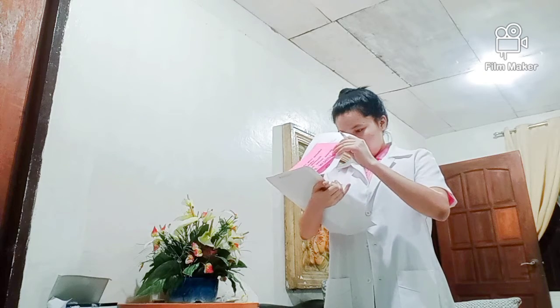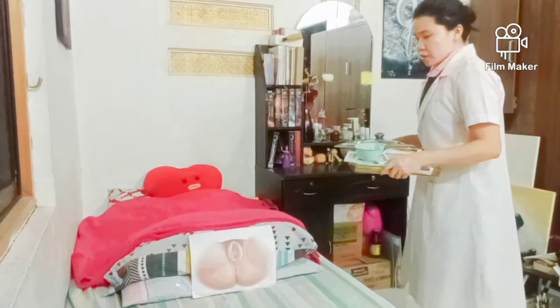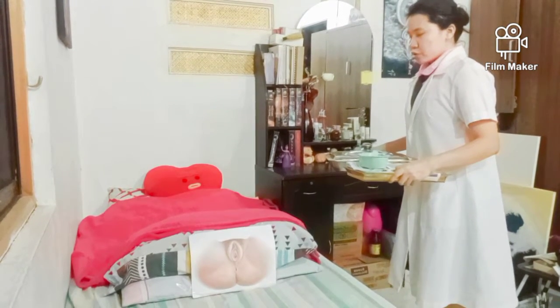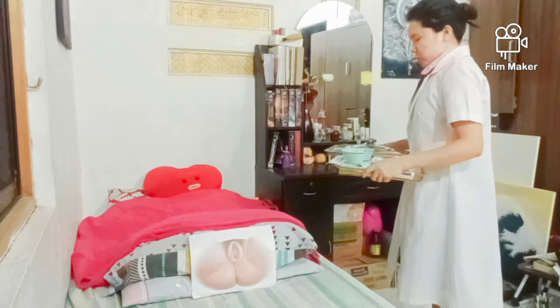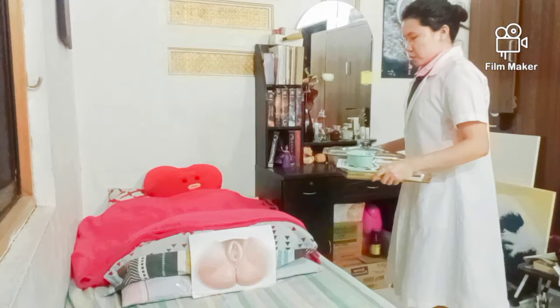Review the patient chart to check the doctor's order for the catheterization. Then approach the patient: 'Good morning ma'am, I am Mara Patrici, your student nurse today. Today I will be performing the catheterization. May I know your name ma'am and your date of birth?'